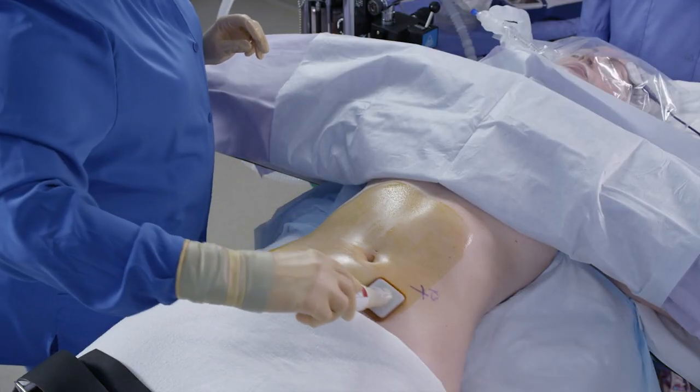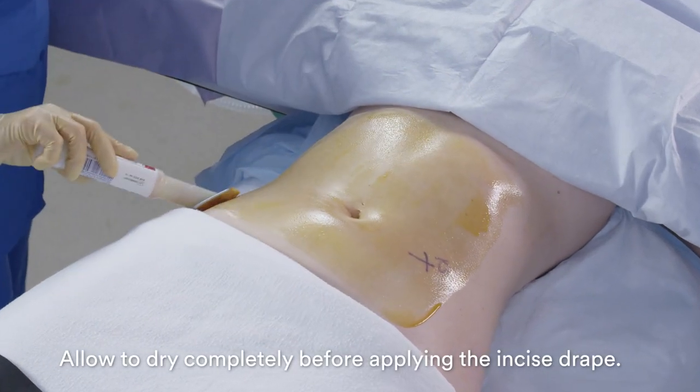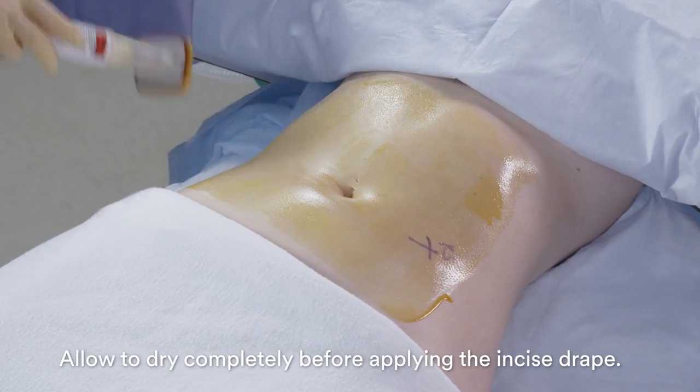After disinfecting the skin with a surgical skin preparation agent, allow the preparation agent to dry completely before applying the incise drape.